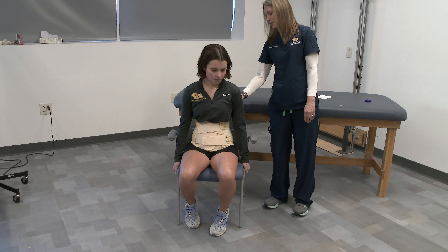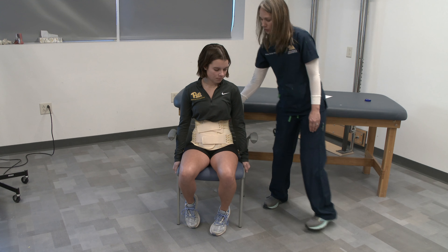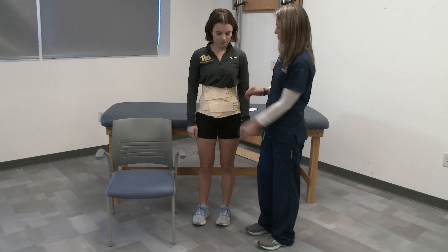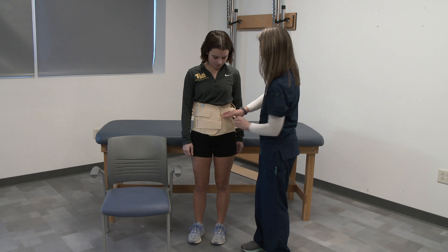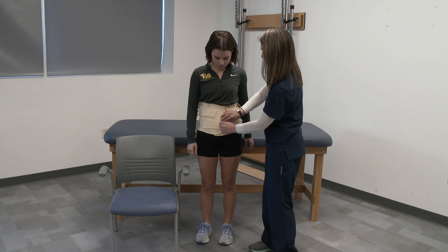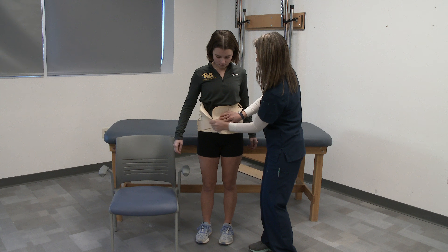Now if you could turn around and have a seat, we will check the fit in seating. You want to make sure that the patient can sit and that she can flex her legs and it clears the rectus femoris on either side. You also want to make sure that it is clearing the xiphoid process and that it doesn't impinge on the inferior angles of the scapula in the posterior section.